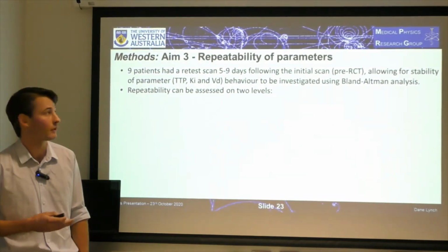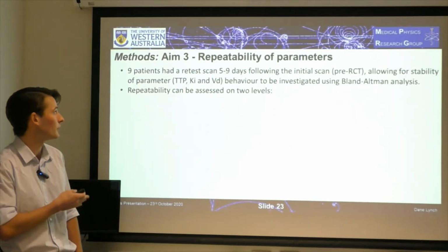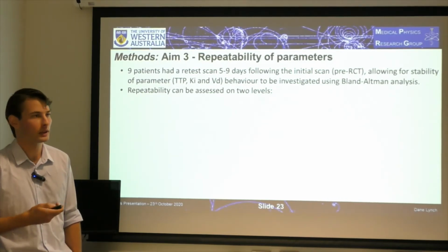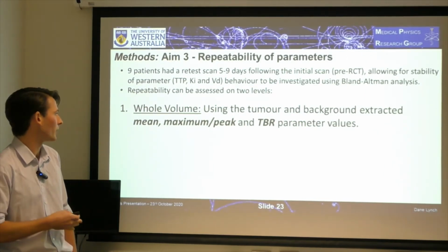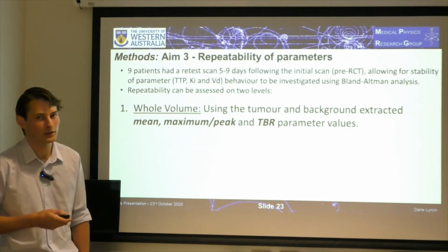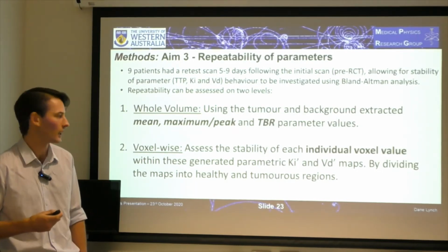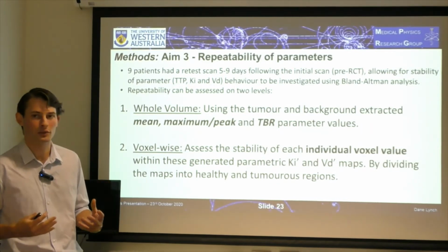So 9 patients had a retest scan 5 to 9 days following their initial scan, allowing for stability of this parameter behaviour to be investigated using Bland-Altman analysis. Repeatability could be assessed on 2 levels. The first level being whole volume, using the tumour and background extracted mean, maximum, and tumour to background parameter values. And also on a voxel-wise level, assessing the stability of each individual voxel value within the generated maps by dividing the maps into healthy and tumorous regions.